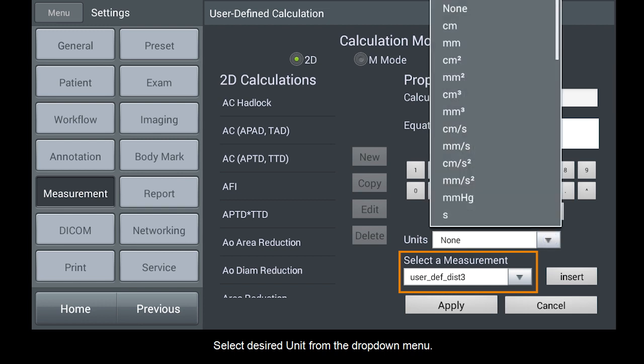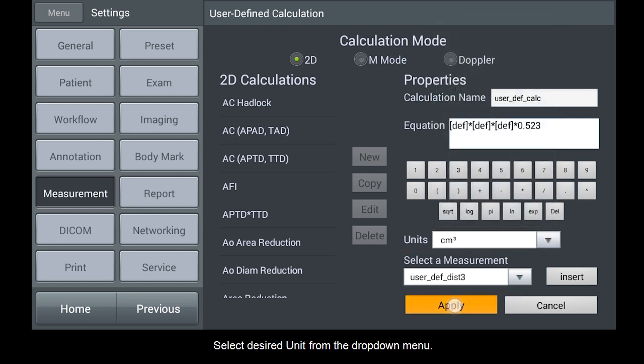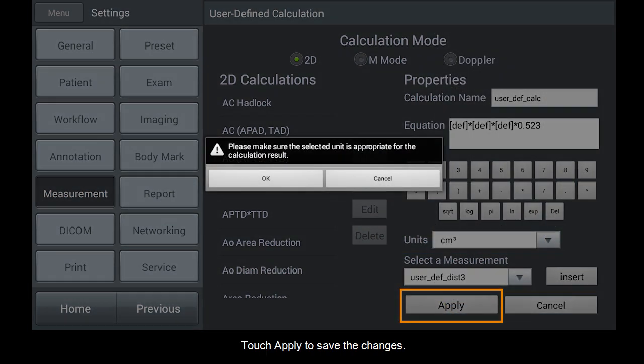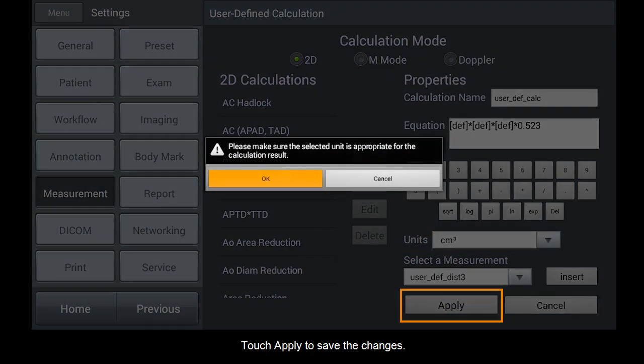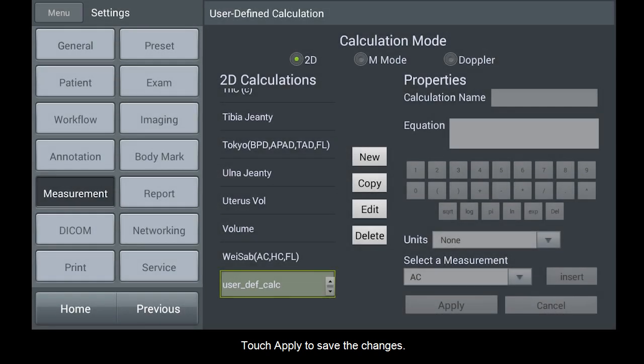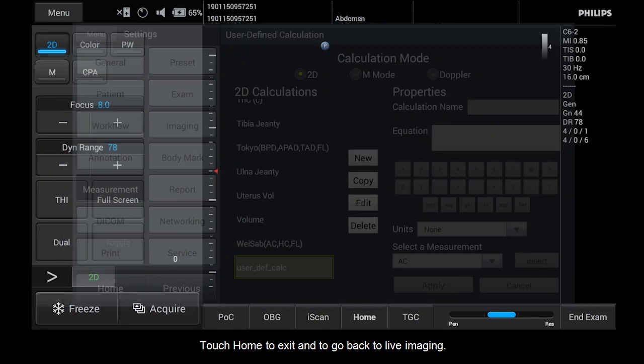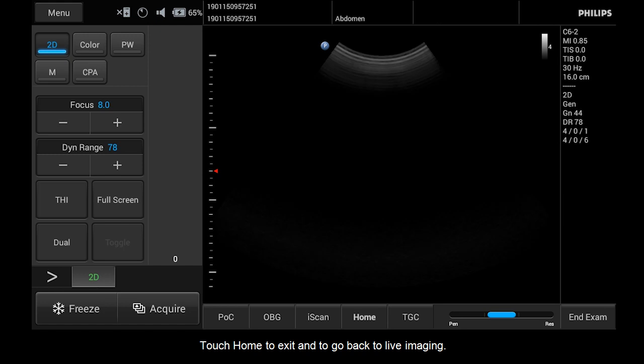Select Desired Unit from the drop-down menu. Touch Apply to save the changes. Touch Home to exit and to go back to live imaging.